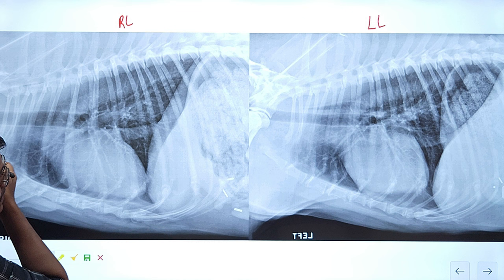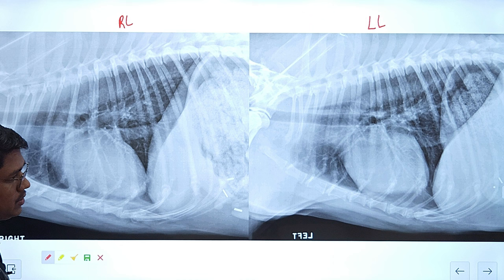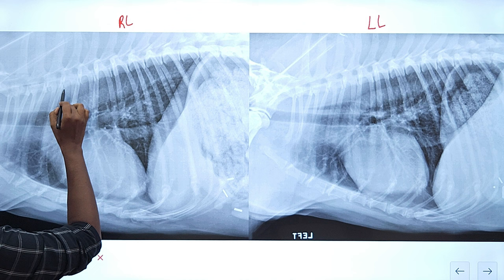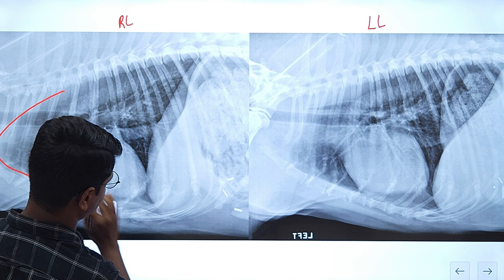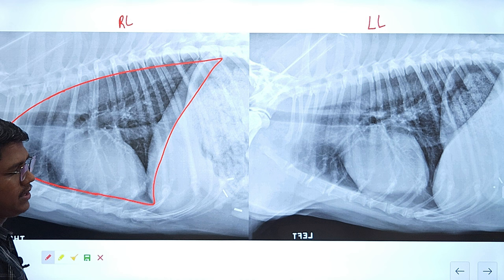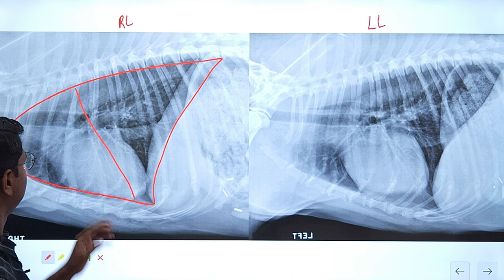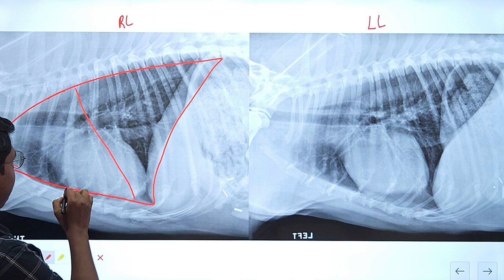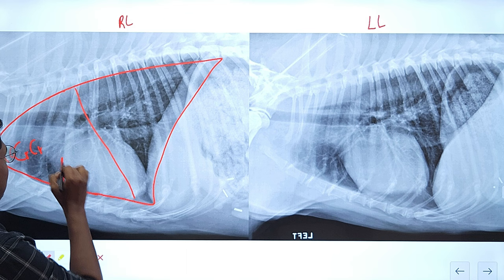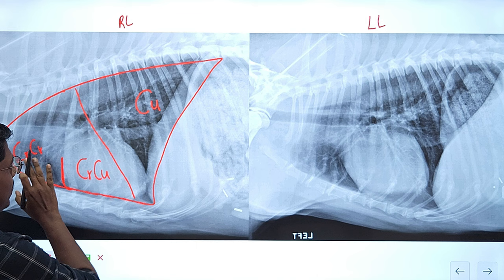In the right lateral radiograph, the right lung is atelectatic, so you are basically evaluating the left lung. The left lung is basically divided into two parts: the cranial lobe and the caudal lobe. The cranial lobe is again divided by a septum into the cranio-cranial and the cranio-caudal. In the left lateral, the left lung is atelectatic, so you are evaluating the right lung.